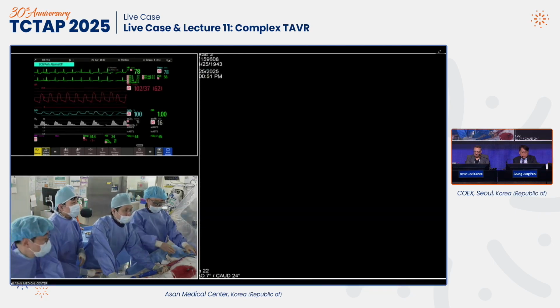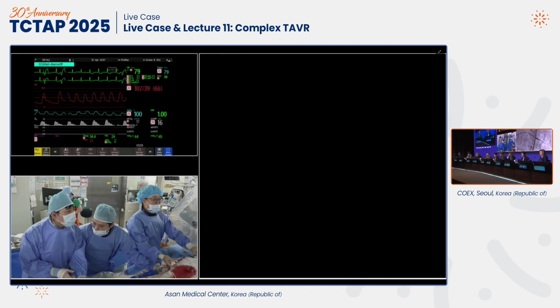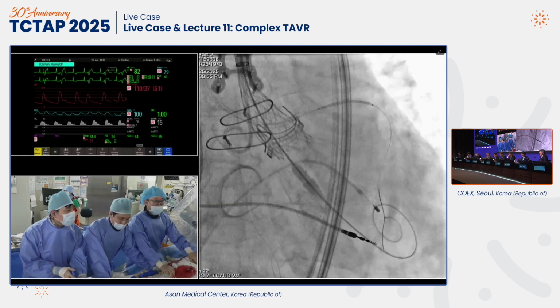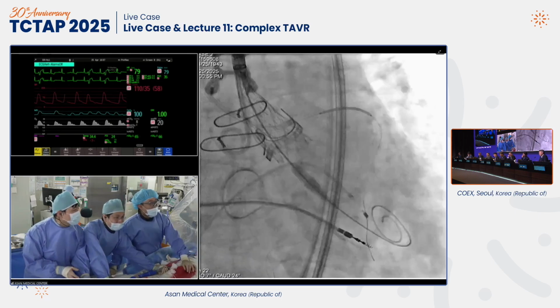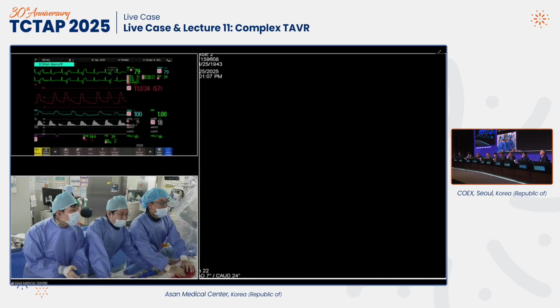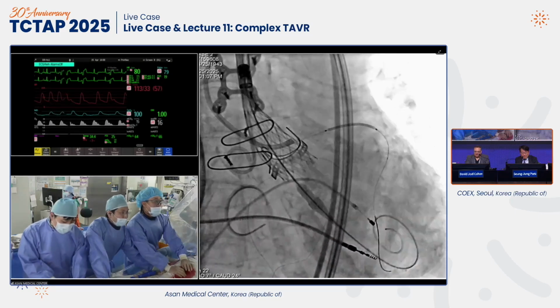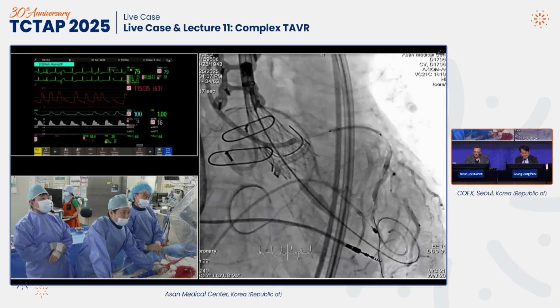I think every audience member and every panel moderator thinks Jung-Min's case was a very easy case compared to ours. We are very nervous. The company is very nervous, right? They make a good valve. Coronary? Good, good. Look at that. Good.